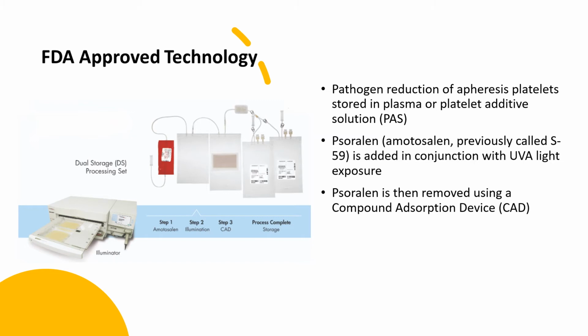This technology has been widely used since its FDA approval, and more blood centers are offering pathogen-reduced platelets in addition to other bacterial risk control strategies.